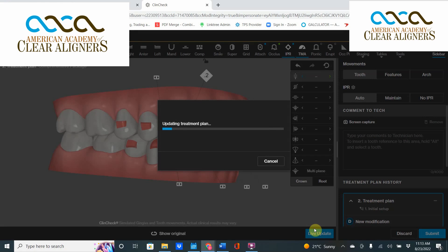Nowadays, through the advent of Live Update, we can make these changes in real time. Again, those movements on the premolars didn't really accomplish anything for me in the case, and there's no reason to move them. All we had to do is hit Modify, then hit the button for tooth click — I was right-clicking on those teeth making them unmovable — and the movement that they had inherent in them will disappear.